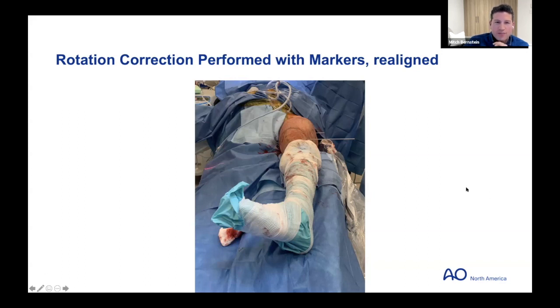Brett, your case, the patient probably had, I mean, he didn't seem to have a lot of hip rotation. He didn't have a big arc of rotation. So he was probably very sensitive to malrotation, is what I suspect. Yeah, supine I thought it was pretty normal at the end, but I agree. Yeah, it was.